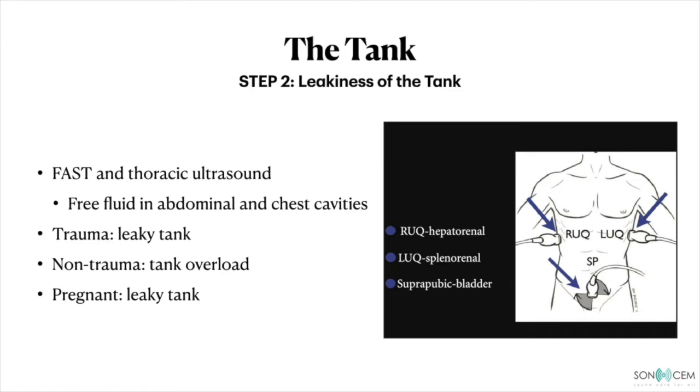While in a pregnant lady, if the patient is in shock with positive free fluid intraperitoneally, that will equate to ectopic pregnancy. It is very important, therefore, to integrate the point-of-care ultrasound findings with the clinical presentation.